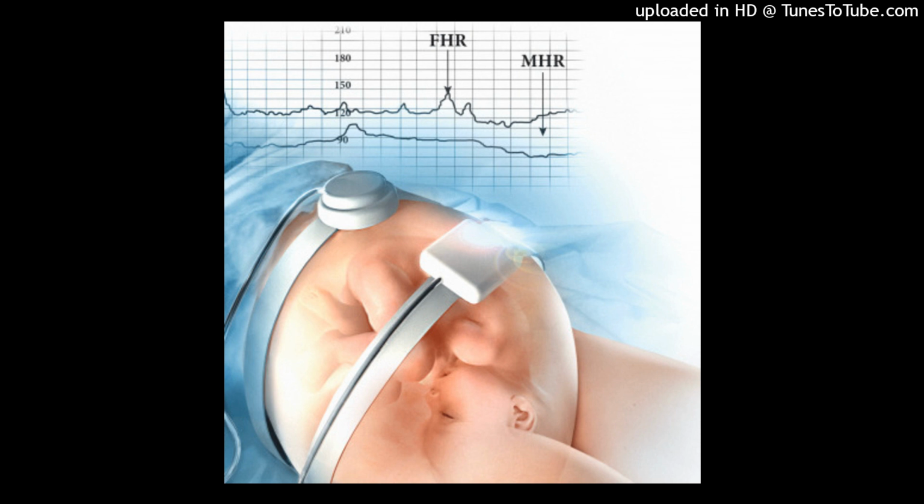Baseline fetal heart rate. Baseline FHR is determined by approximating the mean FHR rounded in 5 BPM increments during a 10-minute period. In this 10-minute assessment, periodic and episodic changes, accelerations and decelerations, and periods of marked variability are excluded.